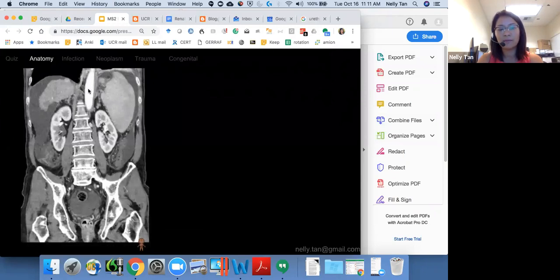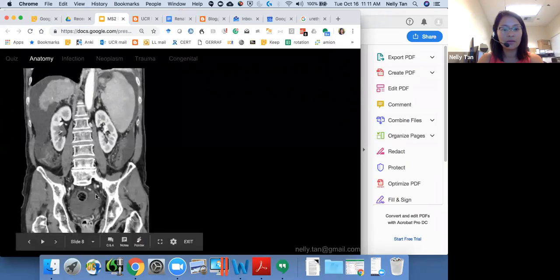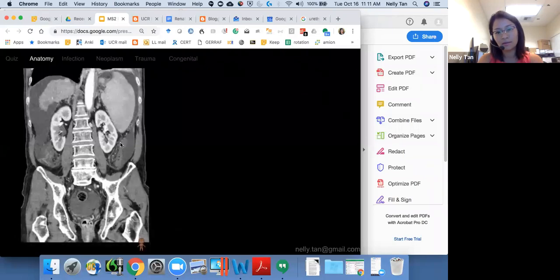Esophagus. Well, it has contrast in it because it's bright. Aorta. Good. Okay, and then what is this thing here? What bowel goes on the right side and the left side along the pericolic gutters? Okay, more specific. Good. Descending colon.